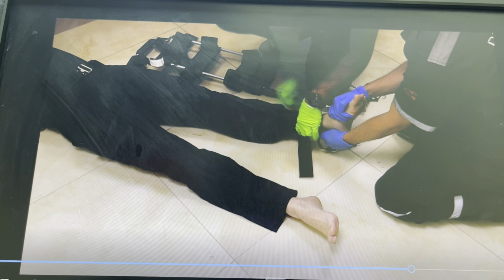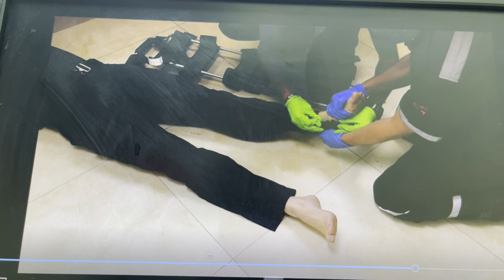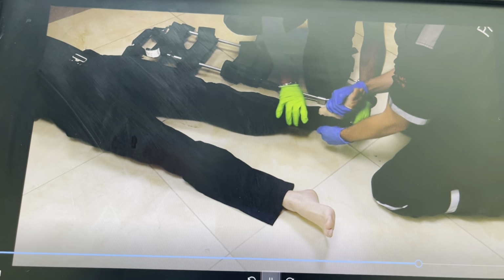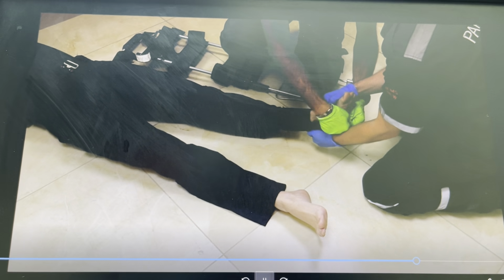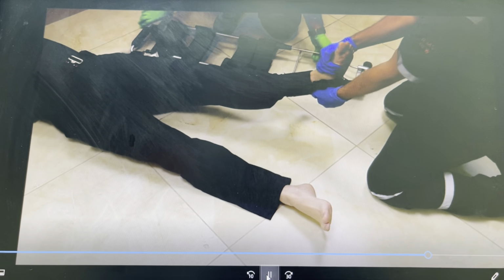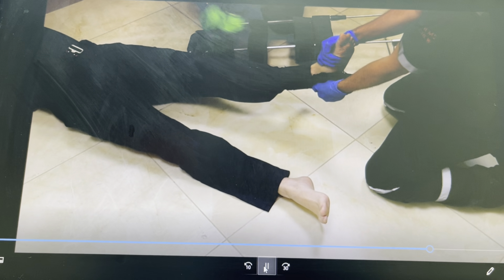Elevate the limb high enough for the splint to be slipped underneath. Slide the ankle wrap under the ankle of the injured leg. The traction strap will extend below the foot. Adjust the ankle strap so the foot is centered on the wrap and the ends of the traction strap are aligned with the ankle bones. Secure it with the fastening strip.